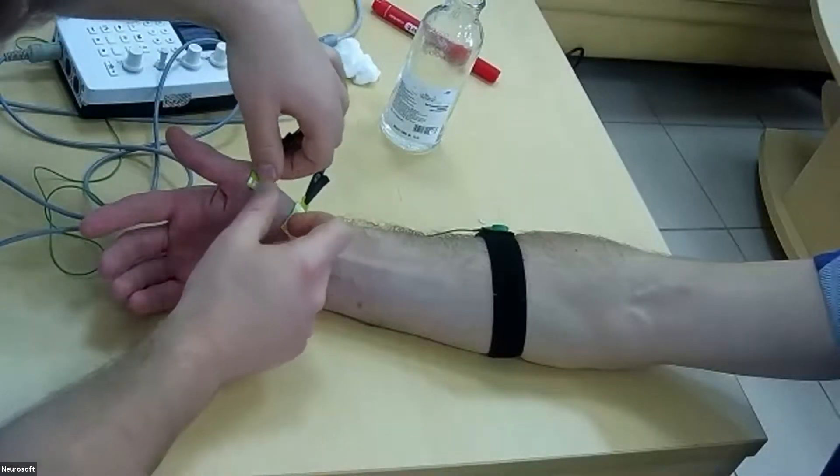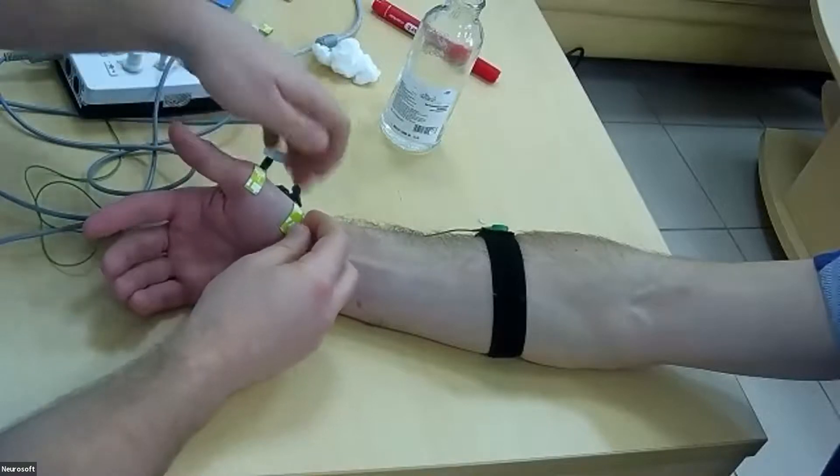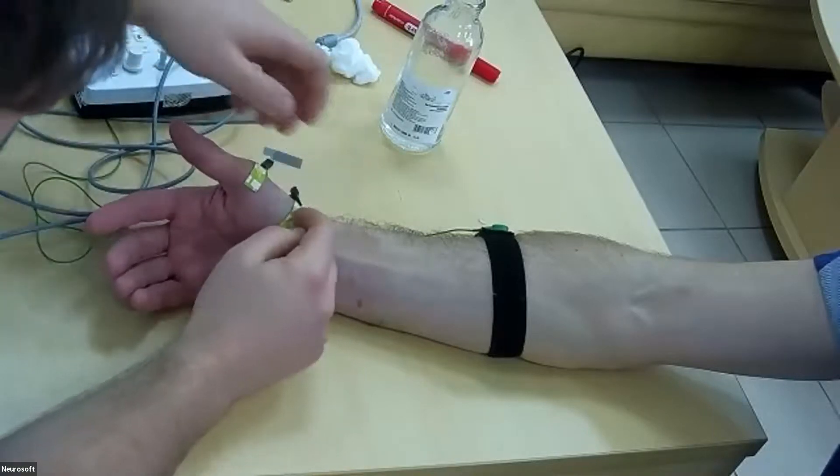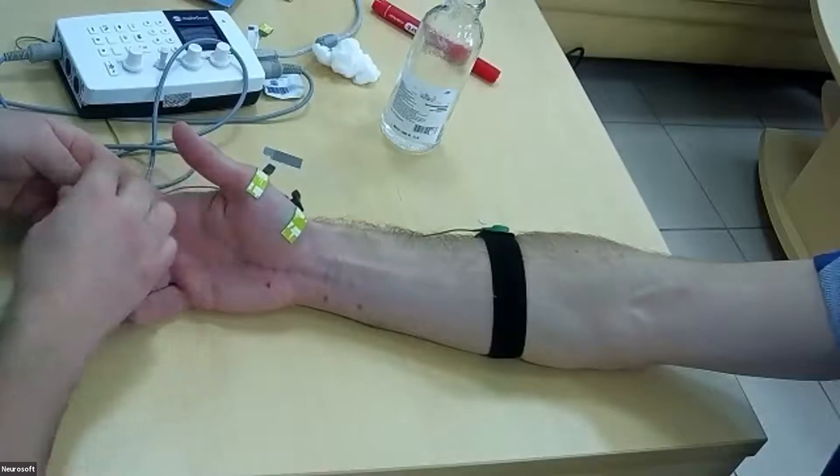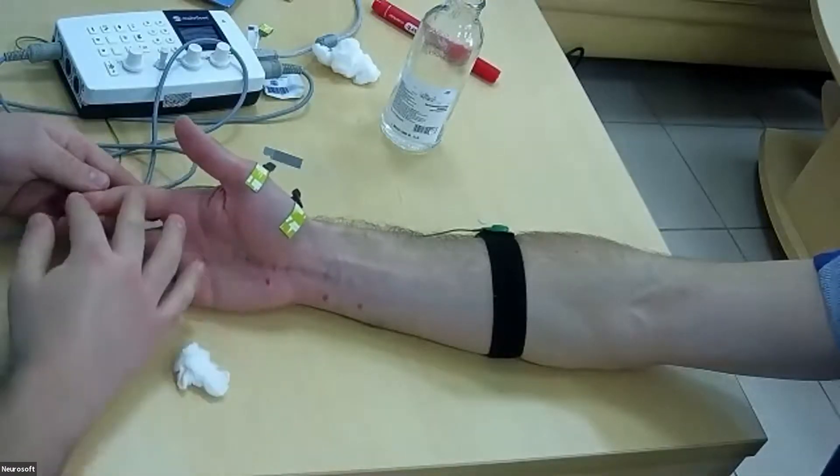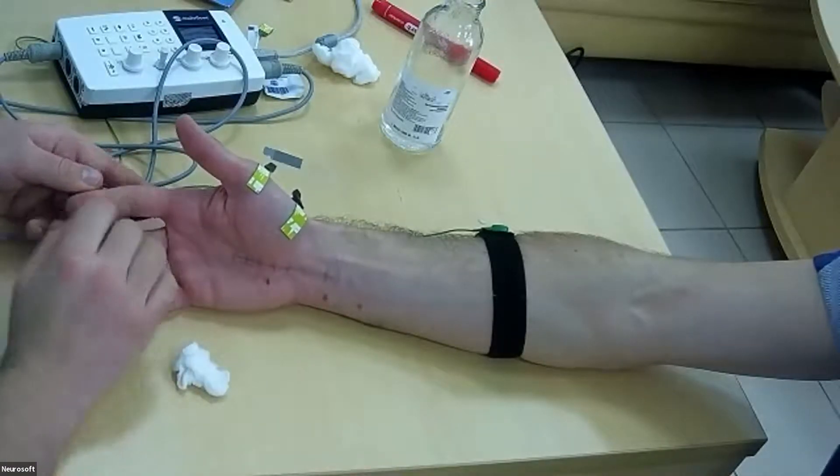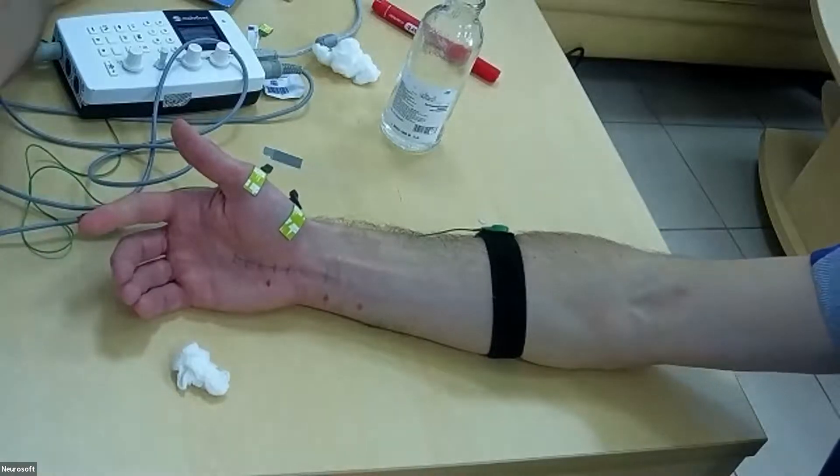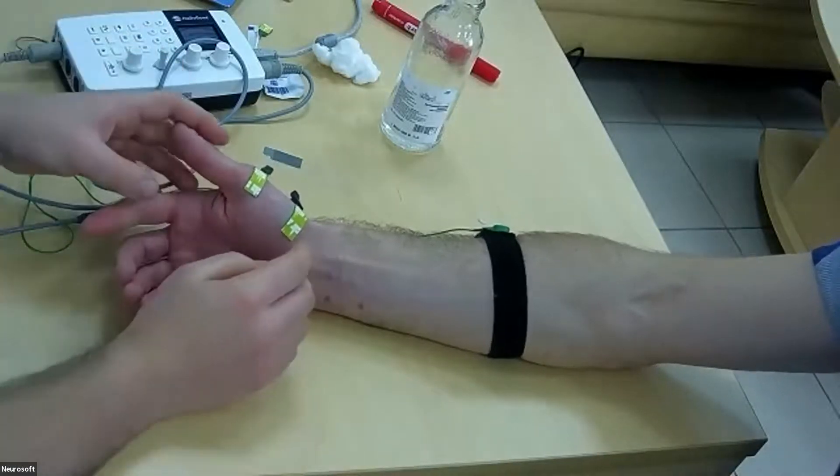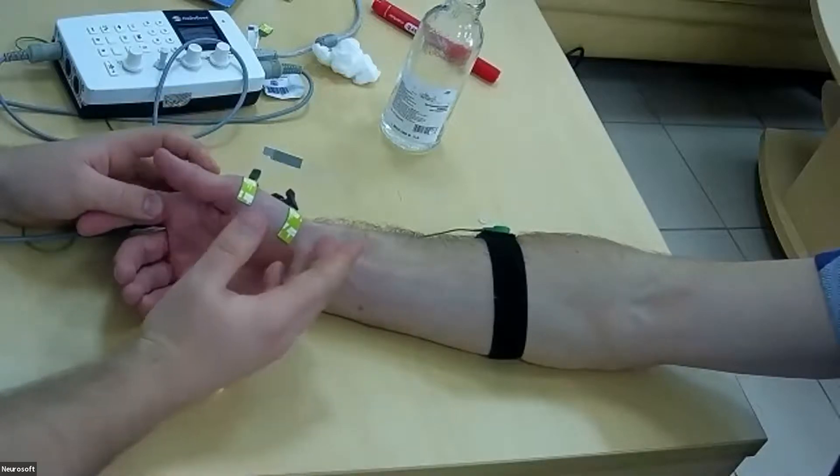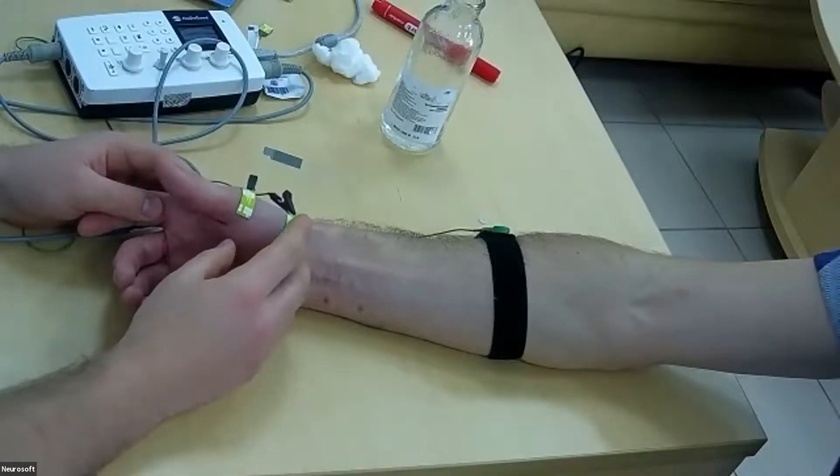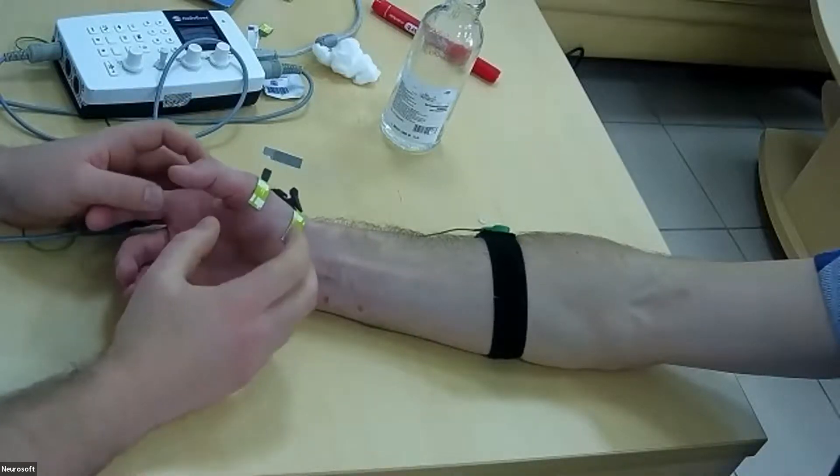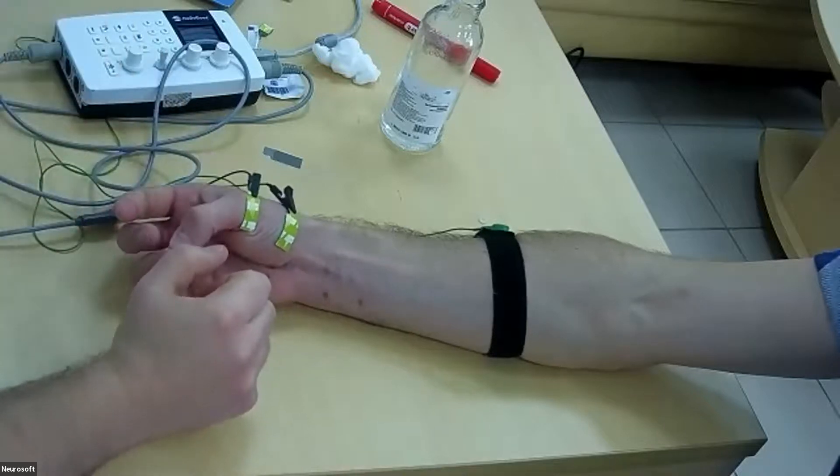So we set the same localization and we will stimulate the second finger with bar electrode. For these methods we ask the patient to tense the muscle.